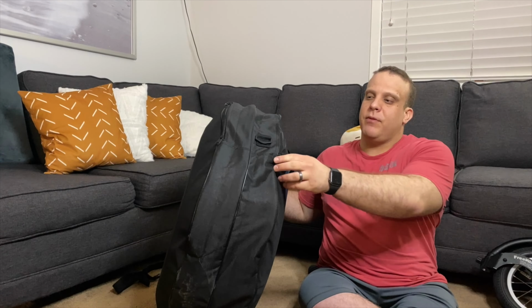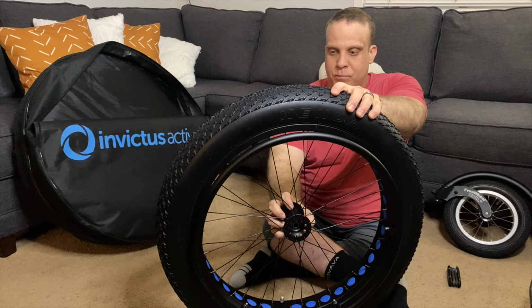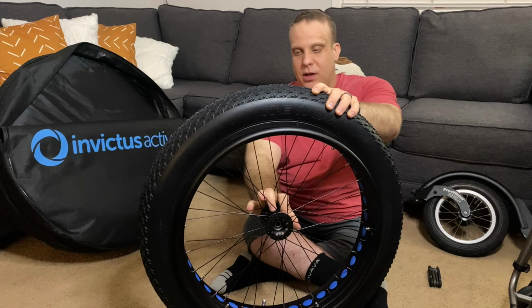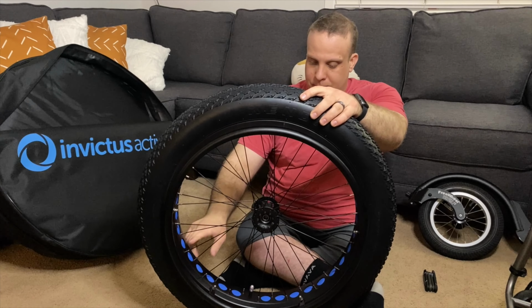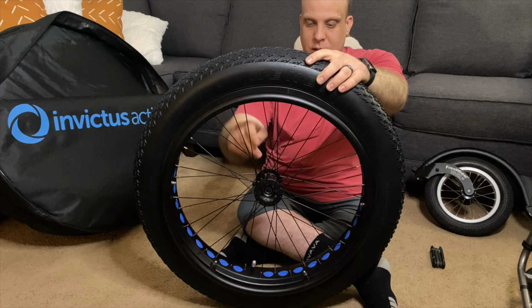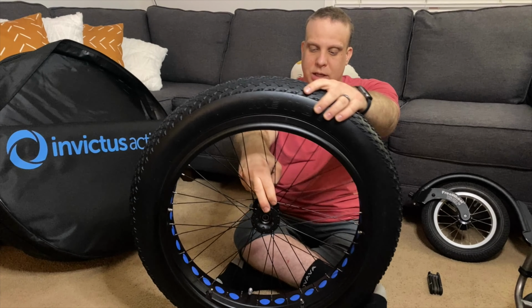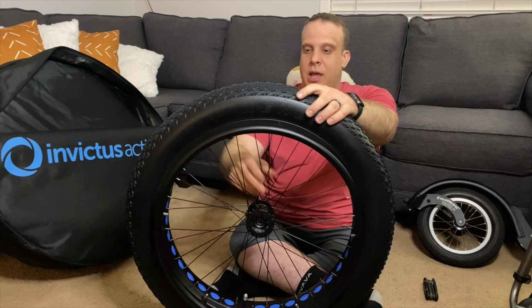So these are a little bit different than my old ones. My old ones had a metal hub that was not solid, but there were two metal plates that made up the hub. This one, the rim is a fat bike tire rim. And this hub here, the center part that holds your axle, is actually a Sun rim, which is a wheelchair company. And then these are high tension spokes.